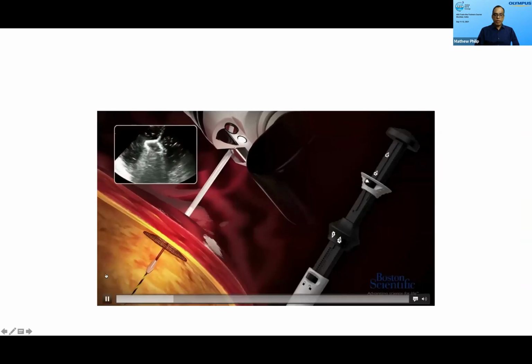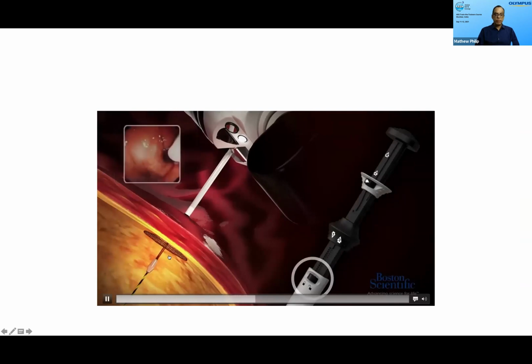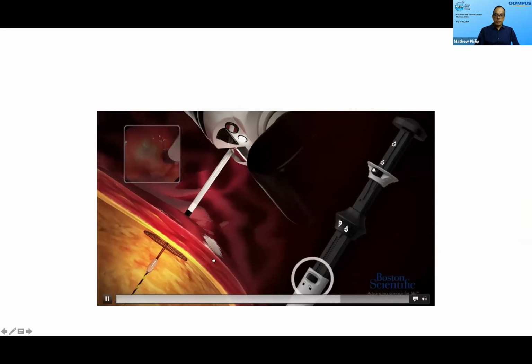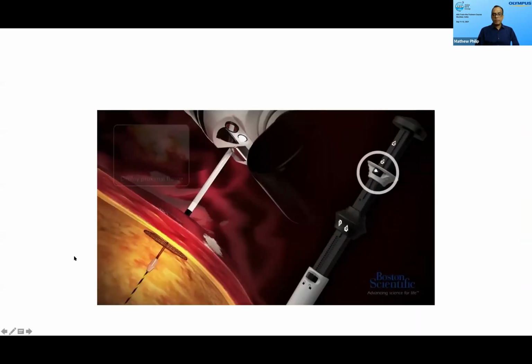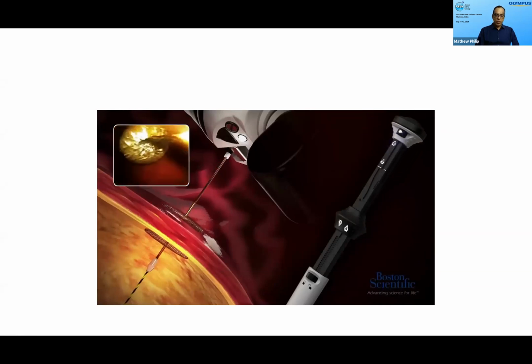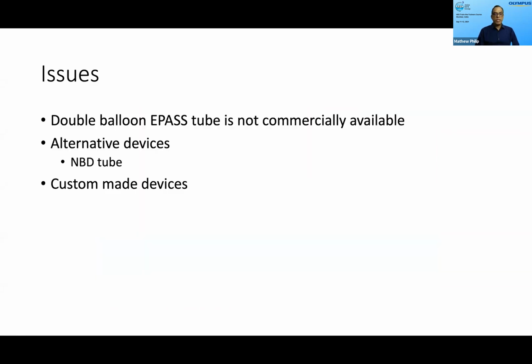Pull the scope backward, deliver the whole delivery system, so that it is opposed towards the gastric wall. Lock it again, the distal one, and the last step is you deliver the whole stent, one portion into the jejunum and another into the stomach.